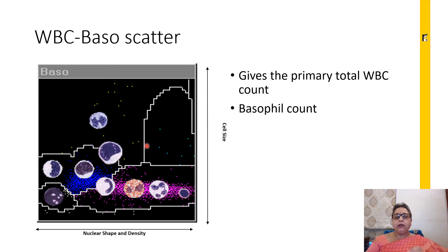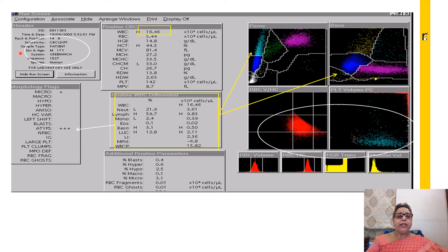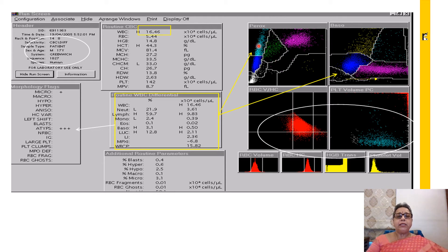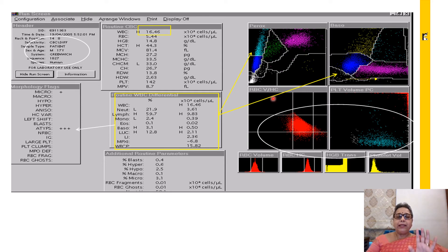Now let's look at a couple of scatters specific to different pathologies connected to the white cells. The first case is a 17-year-old male with a slightly high WBC count. You can see there are large unstained cells and lymphocytes, but hardly any blasts. The LUC is 12.8 percent with a lymphocyte count of 59.7 percent and a flag saying atypical cells present. This should immediately call for a peripheral blood film review, but with increased LUCs, increased lymphocytes, and no blasts, we need to think benign.